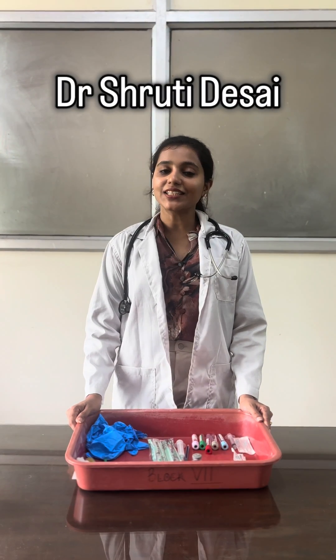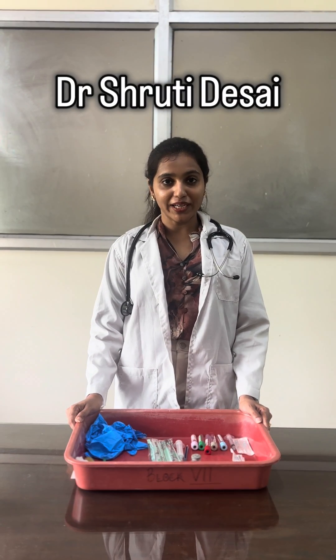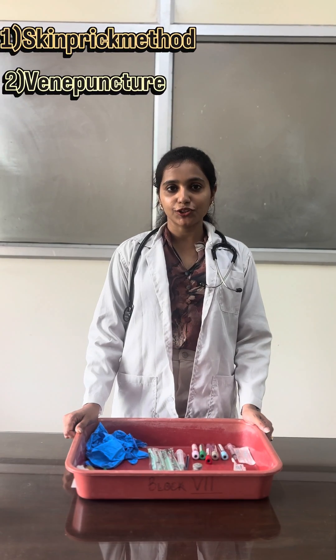Hello, I am Dr. Shtruti Desai and today I will be telling you two methods of blood collection. The first method is by skin prick and the second is by venipuncture.